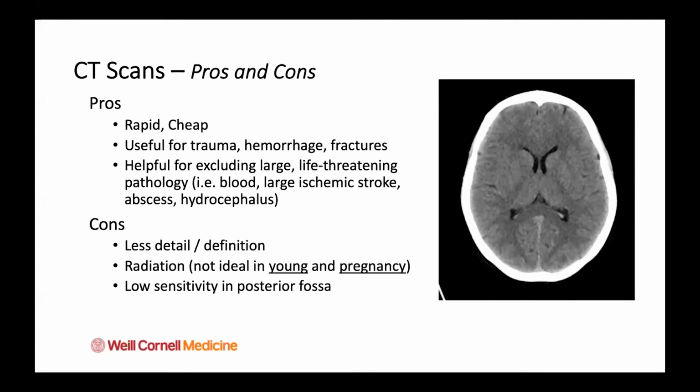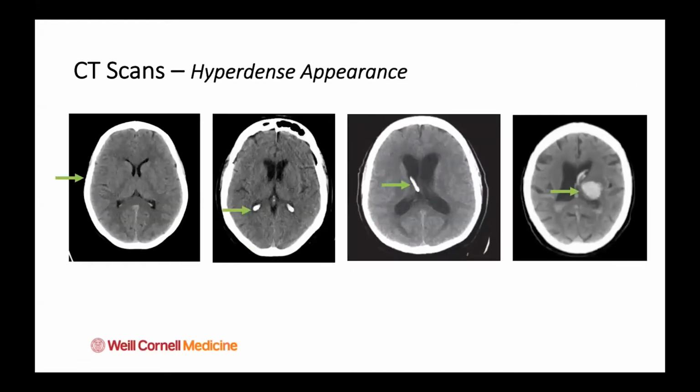The con of it is that it's less detail. It does involve radiation, so not ideal in pregnancy or in younger patients. And it has low sensitivity in the posterior fossa of the intracranial space.